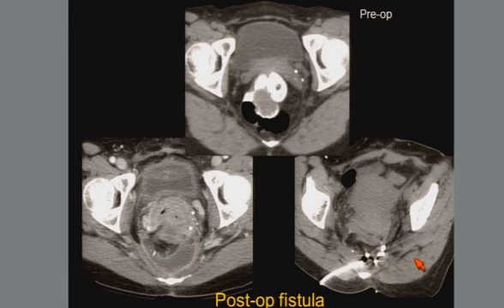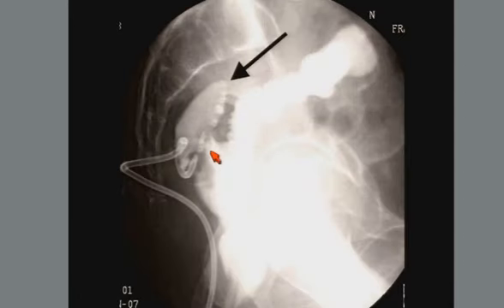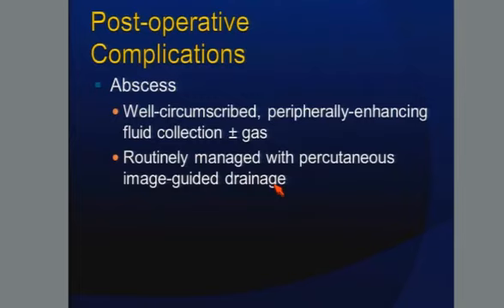You can see our catheter in place, and the abscess is resolved, but the patient continued to come back with collections after the tube was removed. This is him at a different point in time. You can see that we're imaging the anastomosis, and this cavity freely fills with the drain in place. So this is a persistent fistula from a fluid collection.